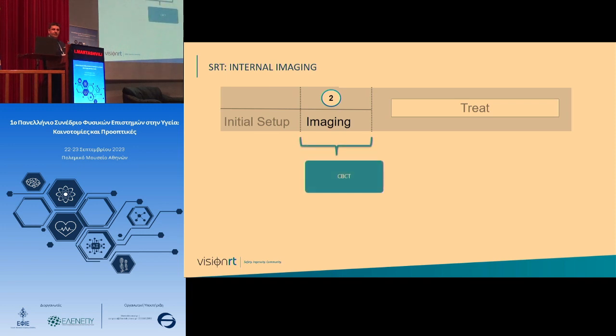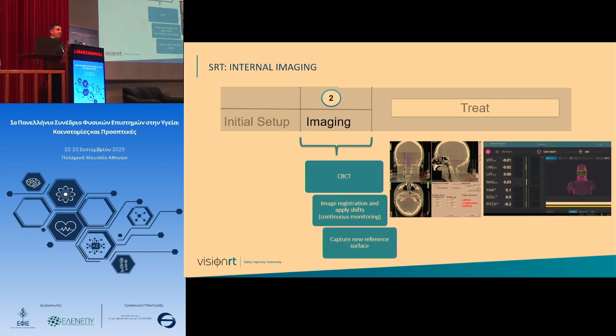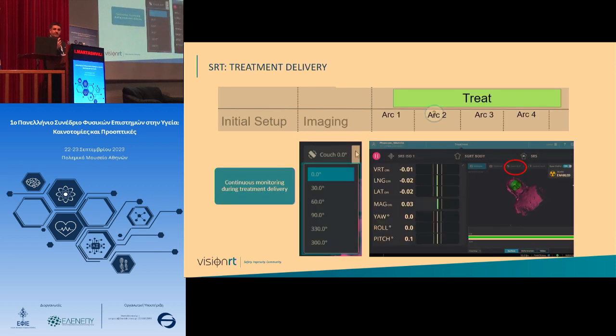After that, you can perform, of course, your internal imaging protocol. Normally, if it's a cranial SRS, you would default to CBCT. The idea here is that after CBCT is done and your internal shifts are applied, you have a possibility, which is one of the stronger points of having AlignRT. You can capture that position with the cameras as a new reference, which was verified with your internal imaging, and then you can track that reference in real time, making sure the patient is staying still in that position, even if you're rotating the couch. So even if you rotate the couch, that reference rotates, making sure in all 6 degrees of freedom your patient is staying where it's supposed to be, okay?